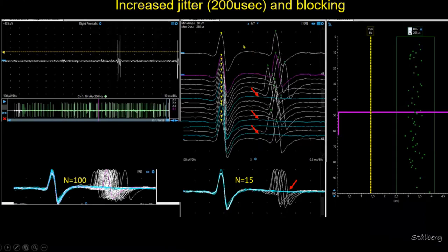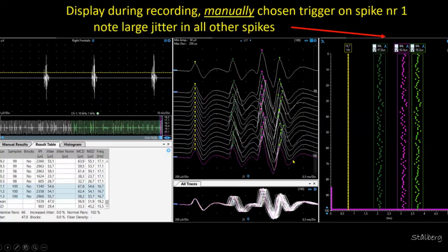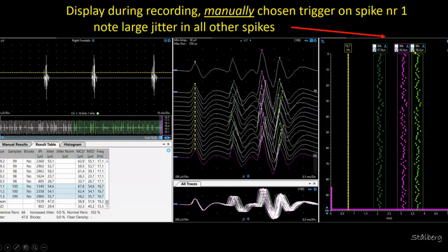Here is a regular situation in a patient with myasthenia, where we trigger on the first and see jitter on the second peak, sometimes also with impulse blocking — so large jitter and impulse blocking. In another example we trigger on the first peak and can measure between peaks 1 and 2, 1 and 3, 1 and 4. If the jitter is very large in the first one, all the others will suffer from that. Triggering on the first gives a large jitter to all others: 67, 62, 58 microseconds.